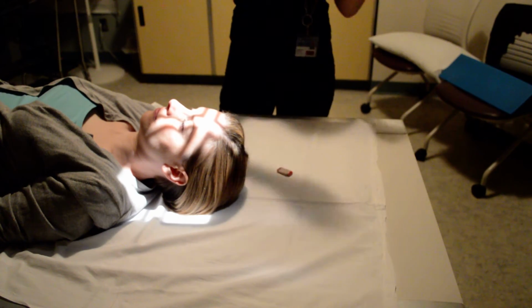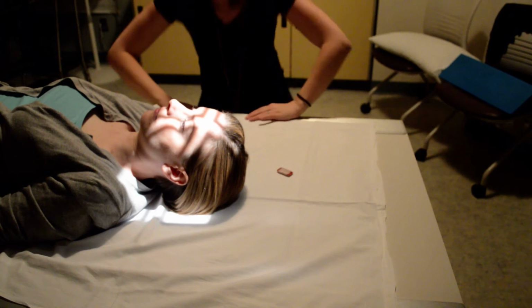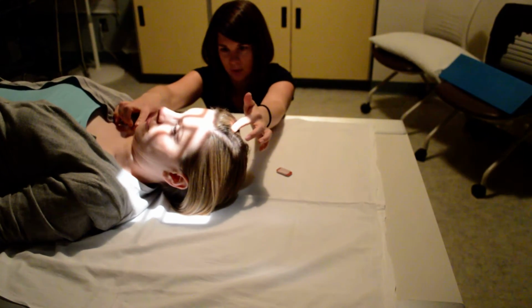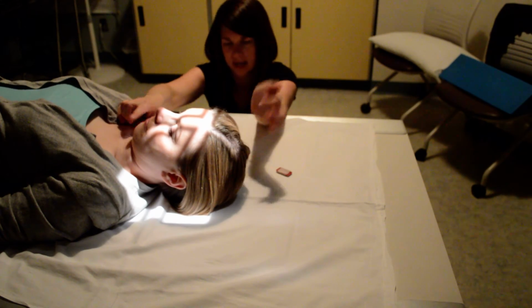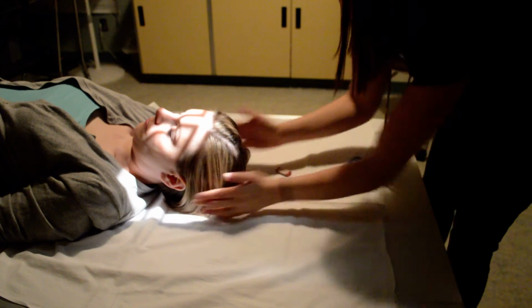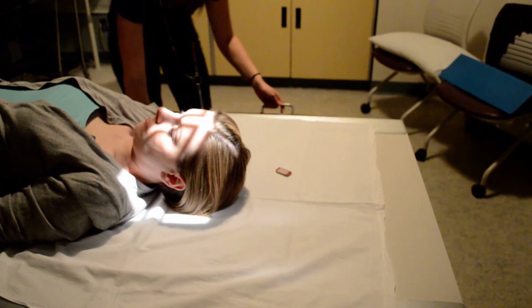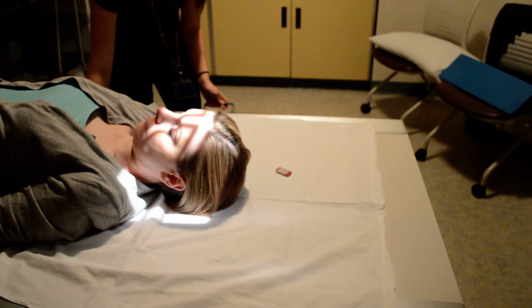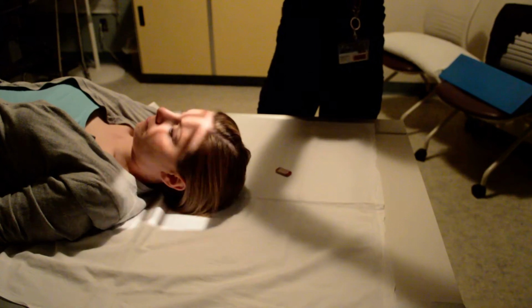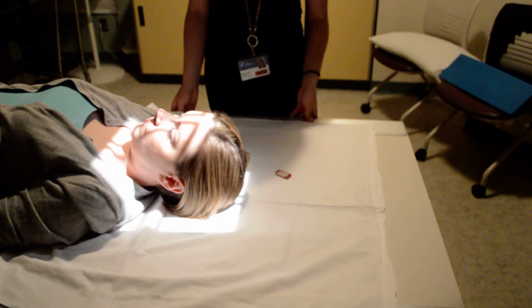Okay, so this one is not a trauma view, so I can go ahead. Remember, I want to use the OML for this, so I'm going to have Libby tuck her chin a little bit for me, a little bit more, to get that OML nice and perpendicular to the table. I can make sure she's not rotated or tilted at all. I'm going to line up my bucky. Get my collimation to match my cassette size, which is still 10x12 portrait.